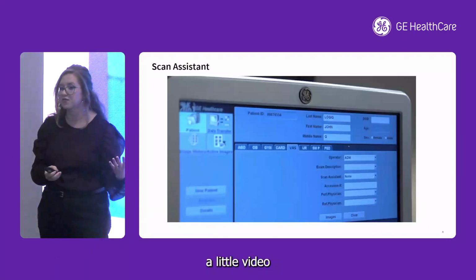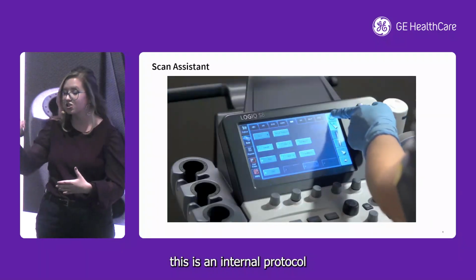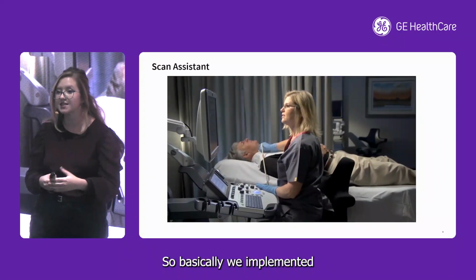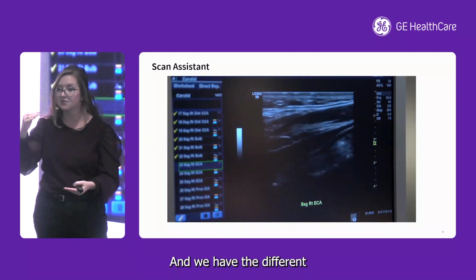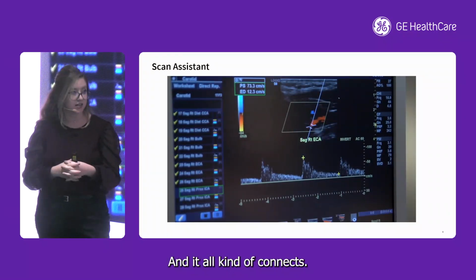So this is just a little video playing in the background, but the basis of Scan Assist is an internal protocol that lets you set kind of what images and in what order you want your tech to scan. So basically we implemented all steps that we wanted for every exam that we scan, every routine exam. And we have the various steps with the labeling, with the measurements, and it all kind of connects.